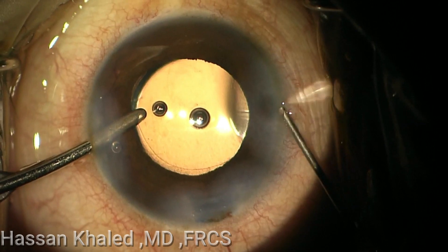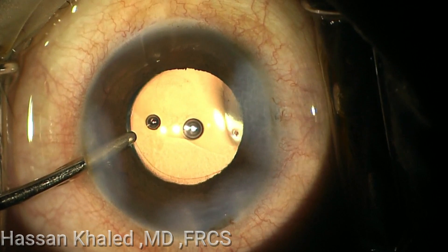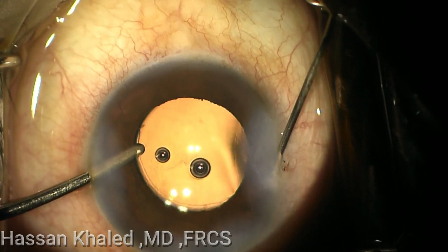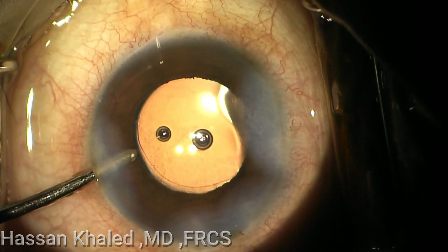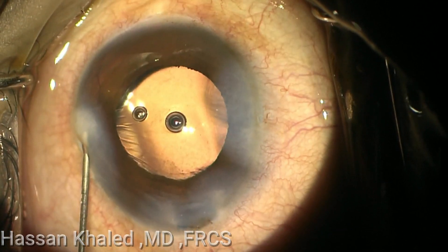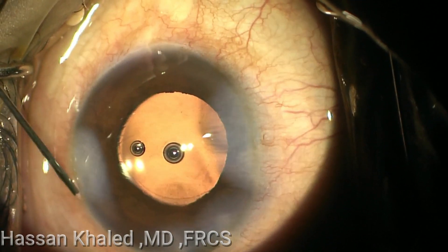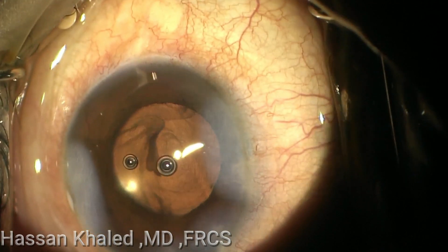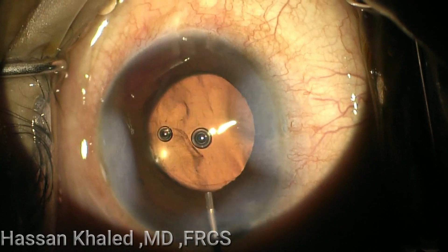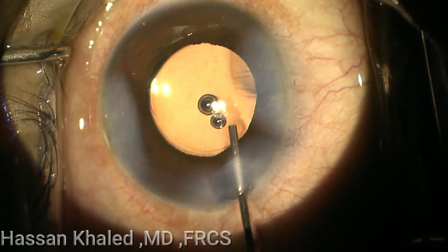In order to elevate the eye pressure and to prevent any leak by the end of the surgery. Again, stromal hydration for the second paracentesis. But you can see the bleeding did not stop. I inject intracameral adrenaline, and you can see now the adrenaline being injected.